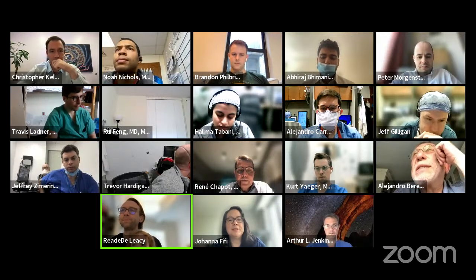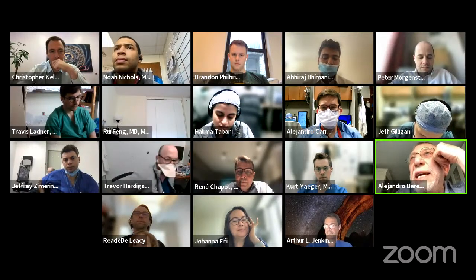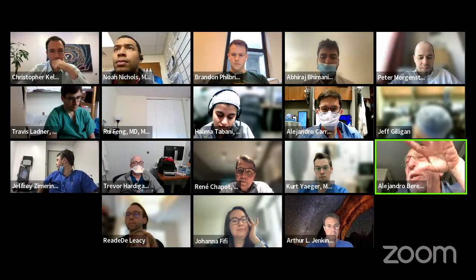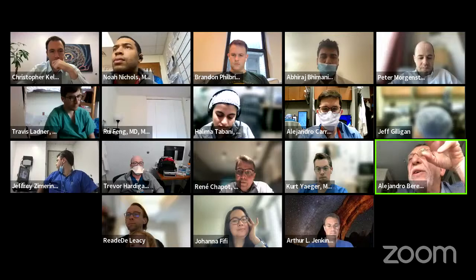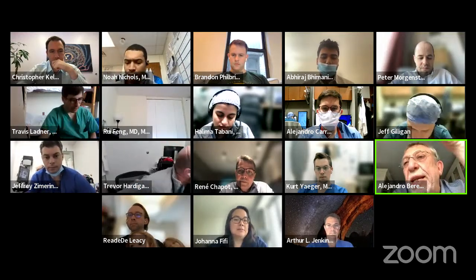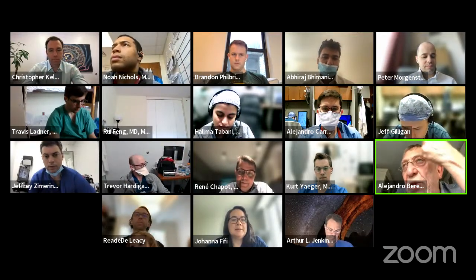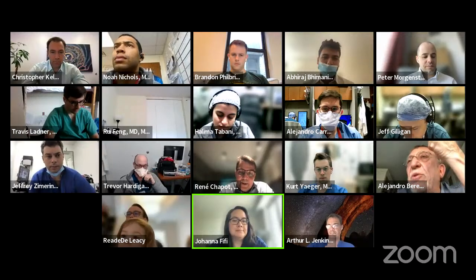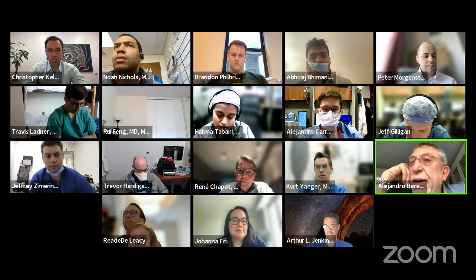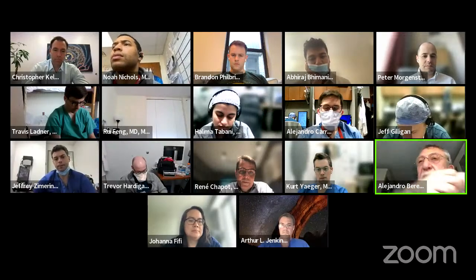Right. Joanna, I think it's hard to say how many you would need and so on. I think the key is to understand this principle that René has introduced, which is the primary veins, dedicated veins, to understand which veins you can sacrifice. The technique of pushing the liquid is the judgment of when to do, when not to do, how much to do. That has been AVM treatment all along, including the surgical treatment. Which vein can I take surgically to use as an anchor to dissect?